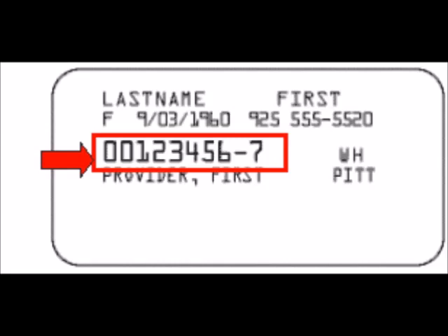account. The physician called the laboratory for the results, and George did not have a legitimate explanation for the missing results on the patient the physician was asking about. George should have rejected the sample and called the nurse to request a new sample.